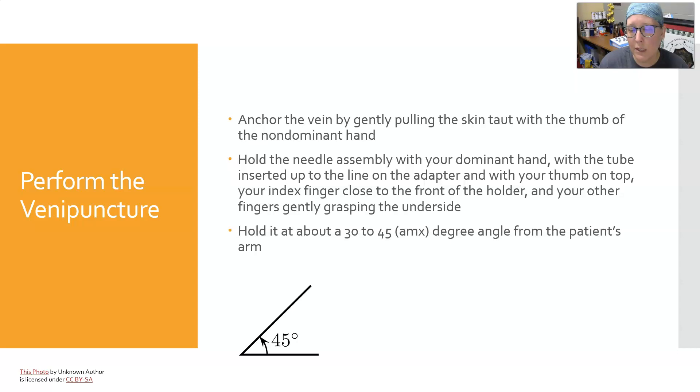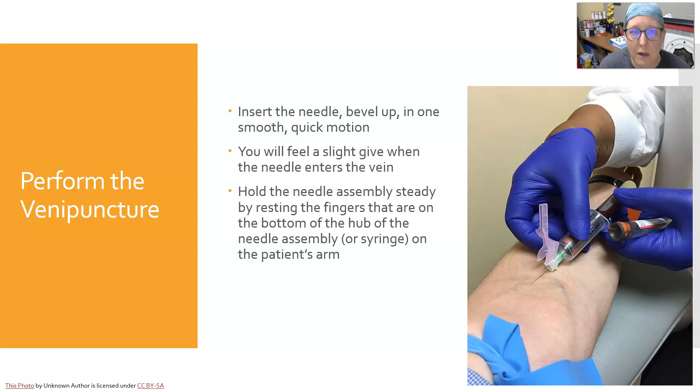Hold the needle at about a 30 to 45 degree maximum angle from the patient's arm — you don't want to go too flat, too steep, or at a right angle. You'll get used to what works best. Insert the needle with the bevel up so the sliced edge of the needle is facing up, and insert it in a smooth, quick motion. You will feel a slight give when the needle enters the vein — this is something you get used to feeling in your fingers as you perform the procedure.